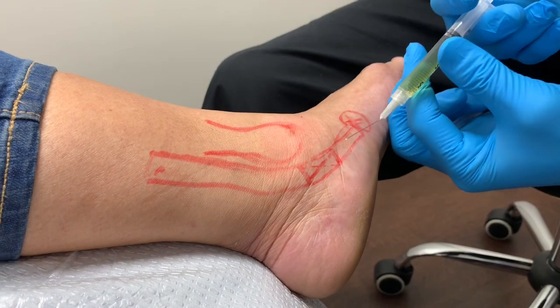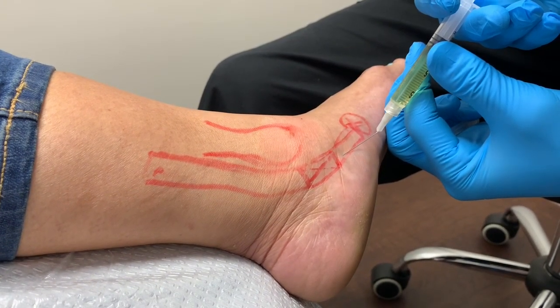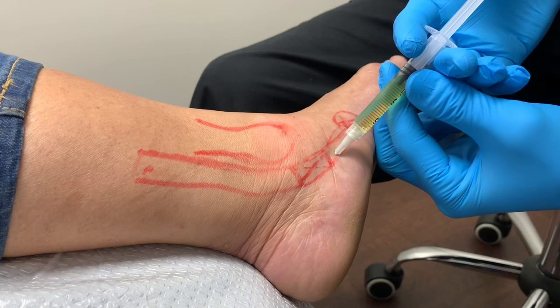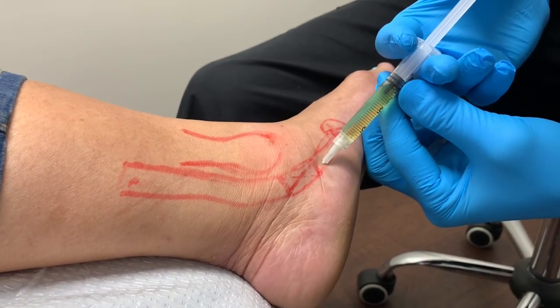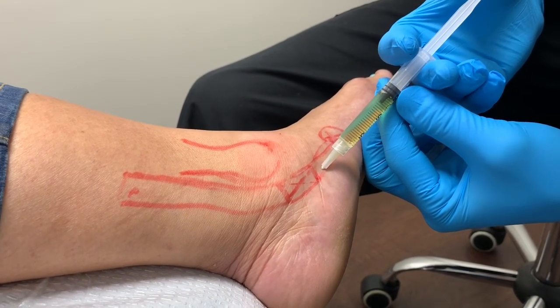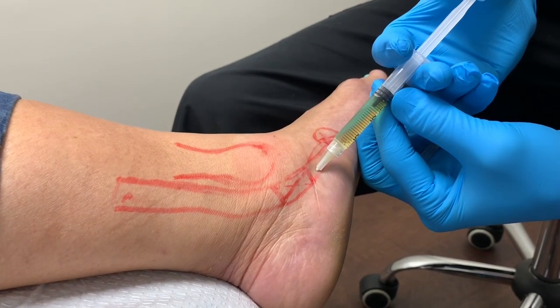Okay. So here we go. Any pain? Just the pinching. Okay, here we go. Okay. So now what we're going to do is we're going to slowly start infiltrating, and we'll ask the patient, how do you feel? How do you feel? Weird.